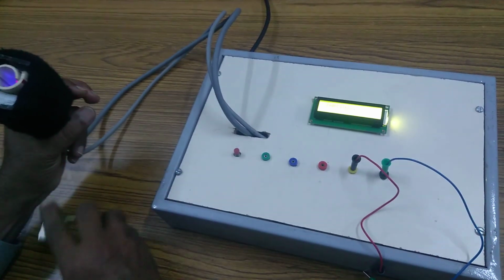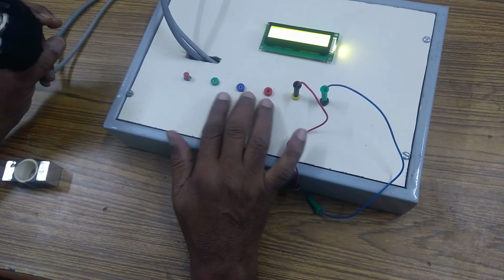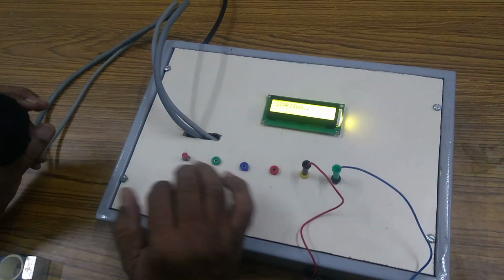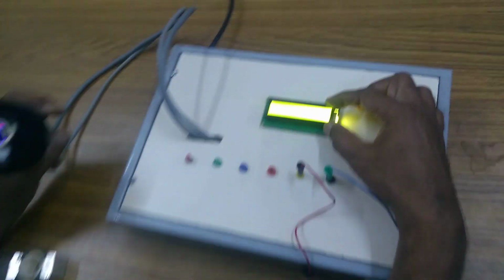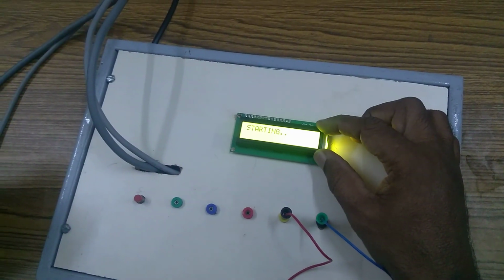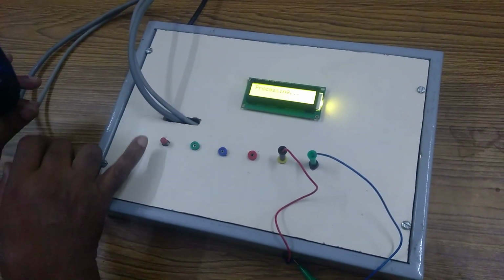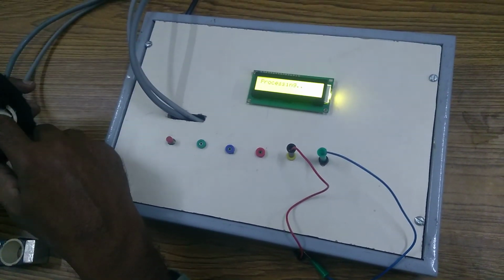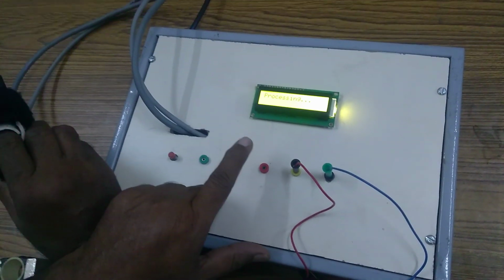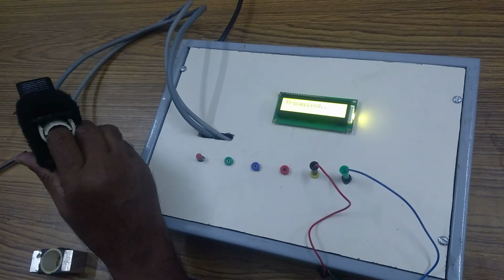Here we have the different outputs. We can observe them on the CRO, which is not needed once the product is finished. After calculating all the ratios, we finally get the output on the LCD, saying whether the person is normal, anemic or sickle cell. When we press the button, the signal is taken from this, it takes all the ratios, and processing starts. Once processing is over, it indicates whether the person is normal or abnormal.